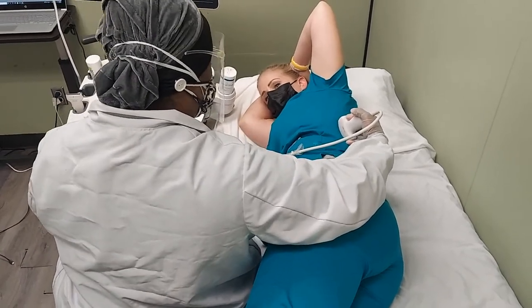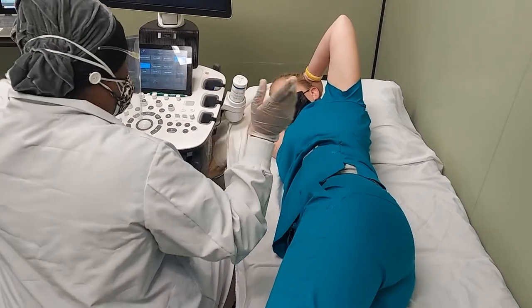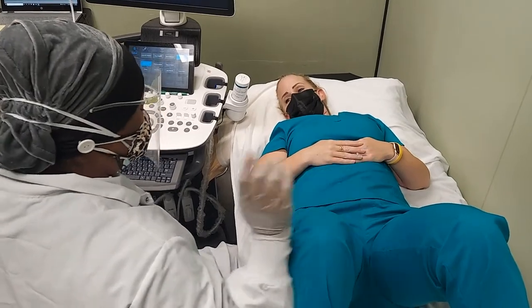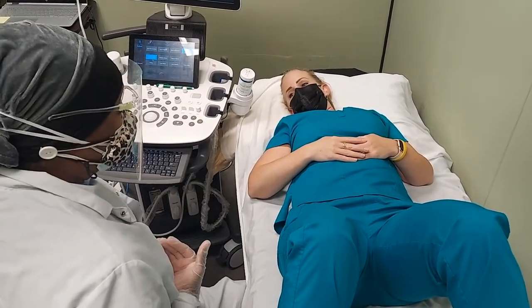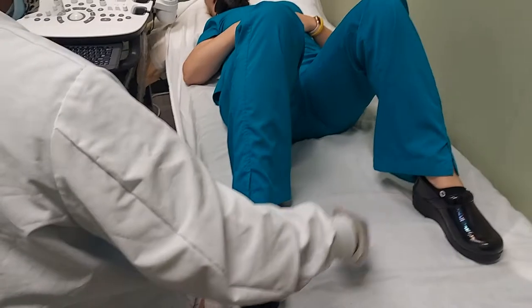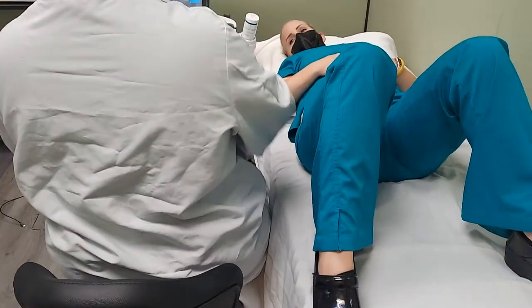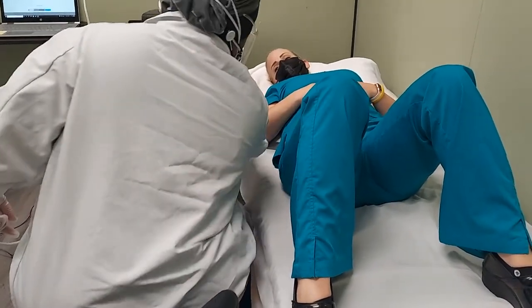Even on right lateral decubitus, scoop the patient as close as possible and still rest your arm on their hips — that's totally okay. I'm not moving or stressing my arm out. You'll have a towel between you and the patient. Don't ever reach, don't ever press hard — it's not healthy for your arm to have a lot of rotation with a lot of stress and pushing.